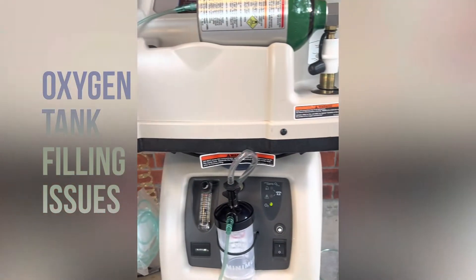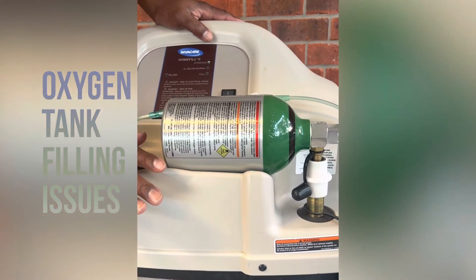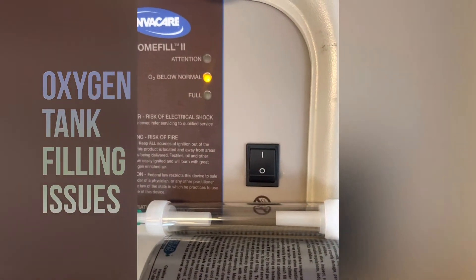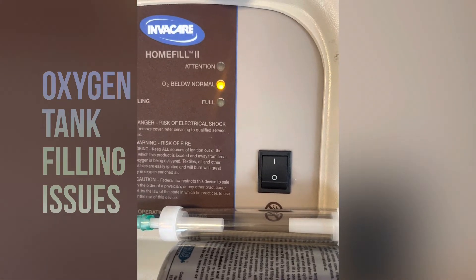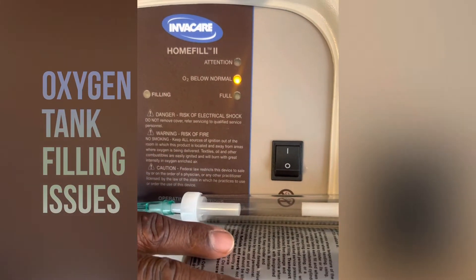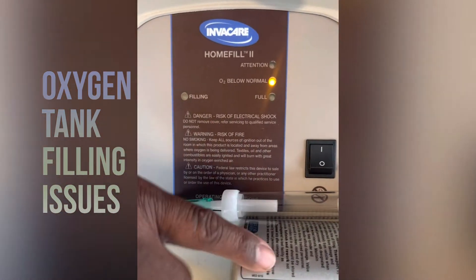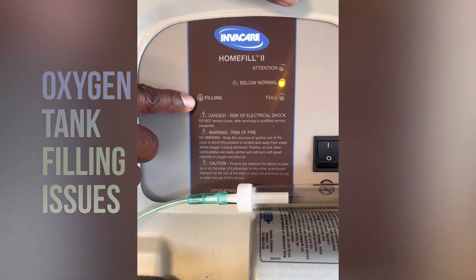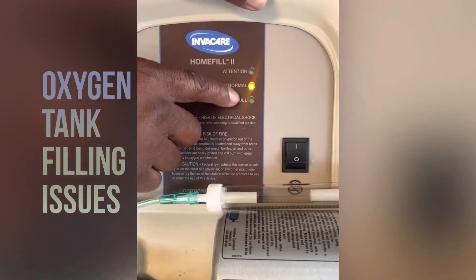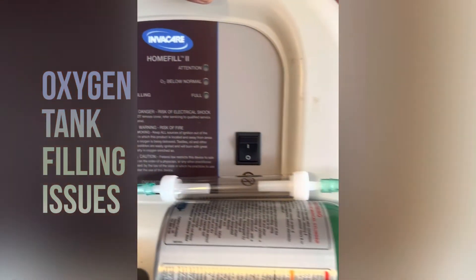If you don't have any kinks in your hose, right above your concentrator is your home fill machine on top. Make sure that you have that machine turned on when filling your tank. It should read below normal first as it checks how much oxygen is in the tank. After that process is done, it'll click over to filling. From filling, it'll go to full — it'll light up green and you'll know the tank is full. At that point, turn your machine off and retrieve your oxygen tank.